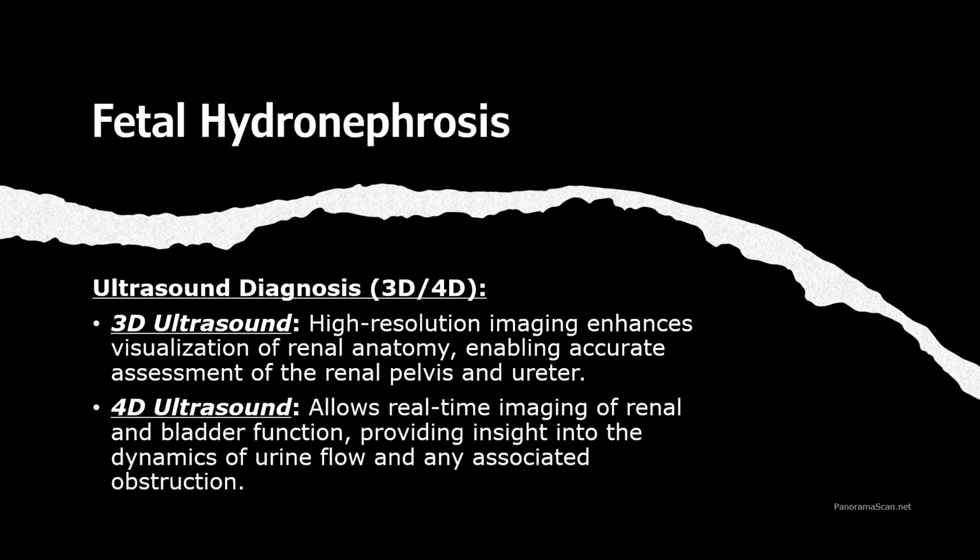4D ultrasound with the real-time imaging capabilities enables us to dynamically observe renal and bladder functions. It provides insights into the flow of urine and helps us assess any obstruction that may be present.